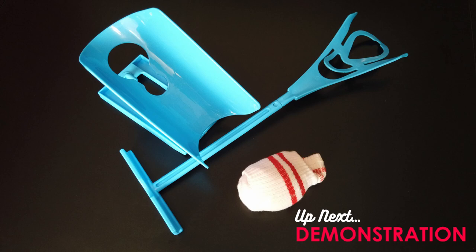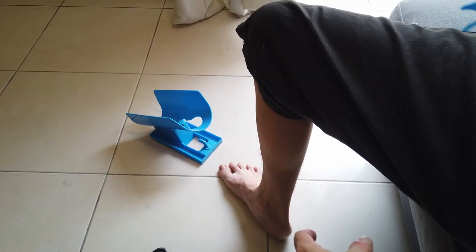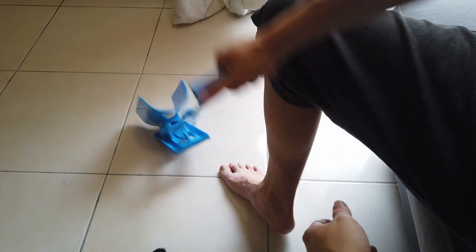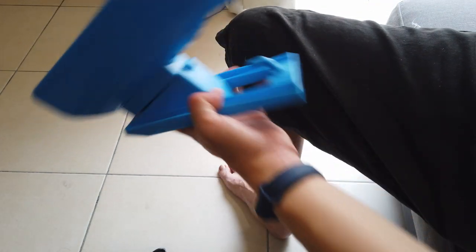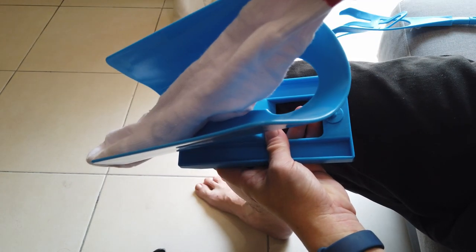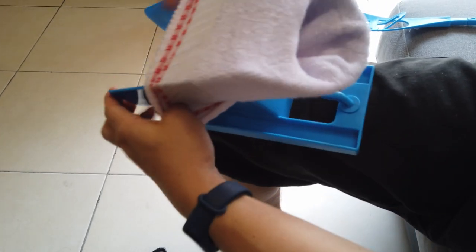Next, we're going to do some demonstration. I have here with me the cradle on the floor, which I'm going to use the handle to pick it up easily. You can then prep any socks that you want on the cradle, and then we're going to place the socks into the holder here. Just open it up and tuck it all in.